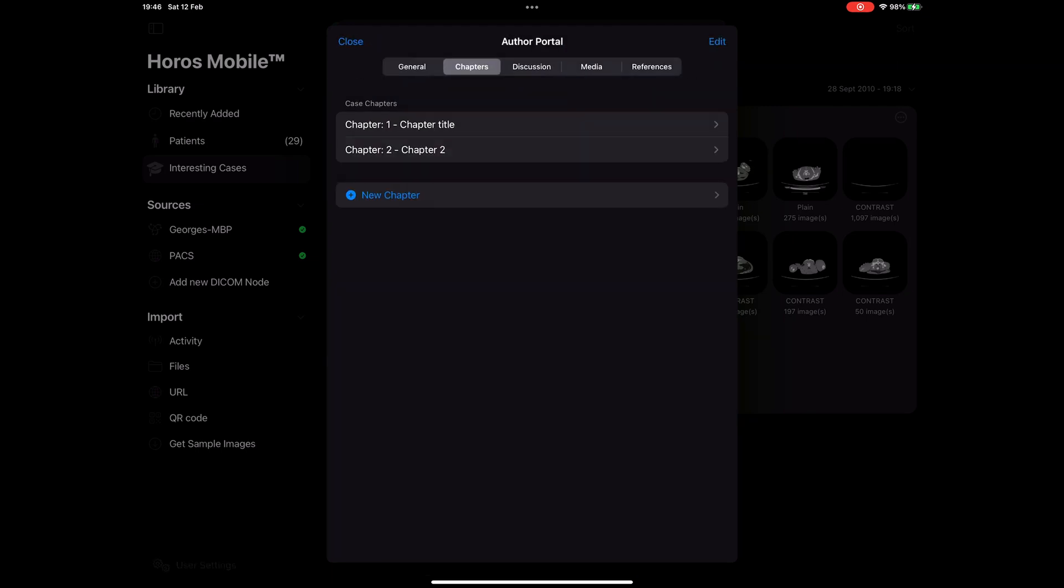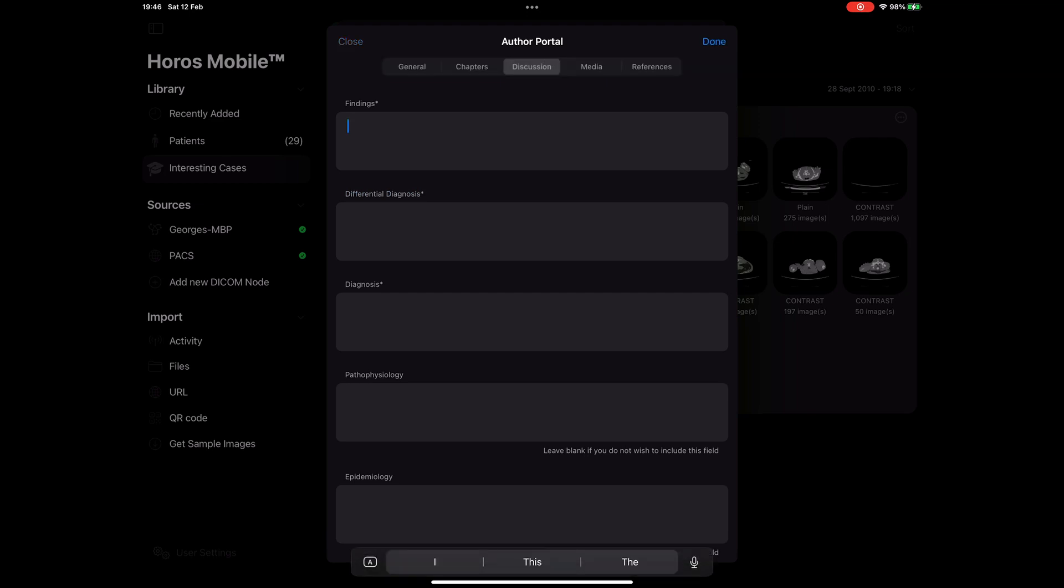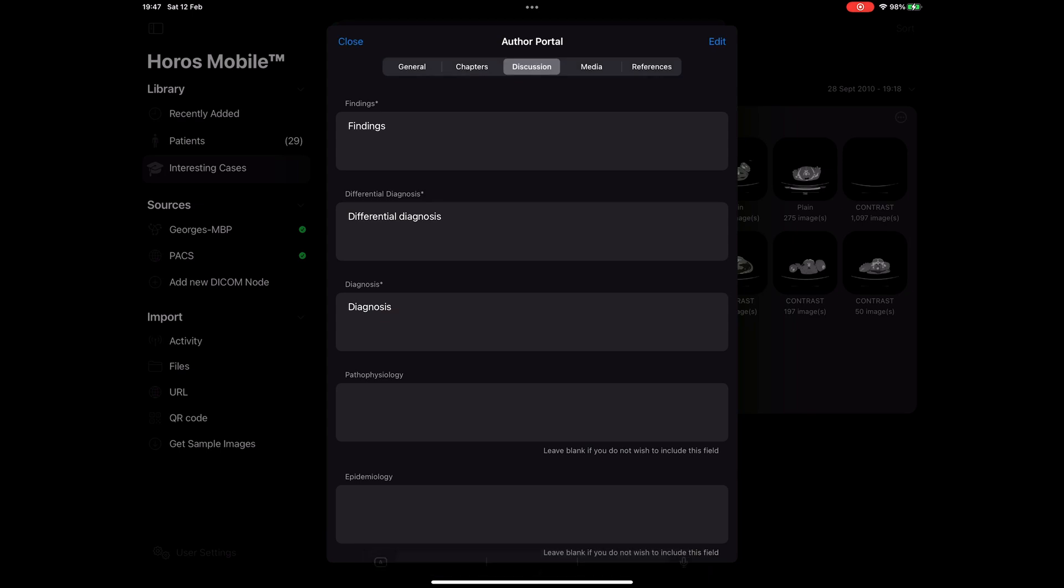I can now go to the discussion tab. In this tab, I can give a little bit more information about this case. For example, I can fill out the findings section, the differential diagnosis, the diagnosis, pathophysiology, etc. If I leave any of those fields blank, they will not be displayed when users view my case, so I don't have to worry about what needs to be displayed or not. It just works.